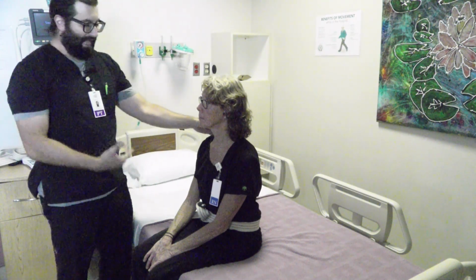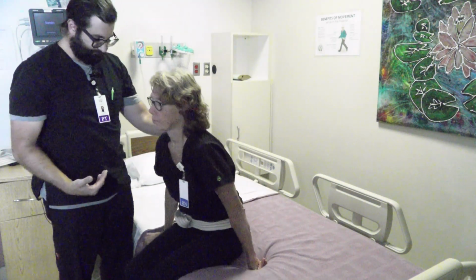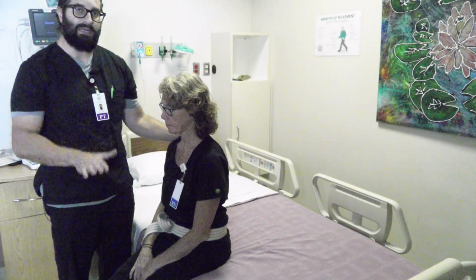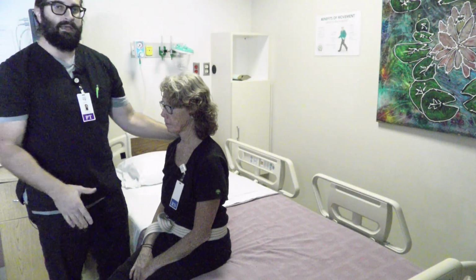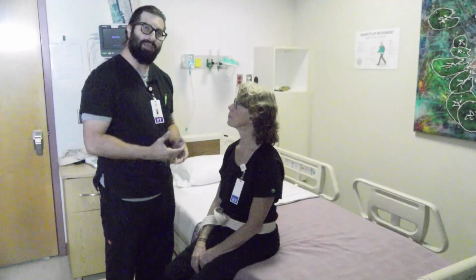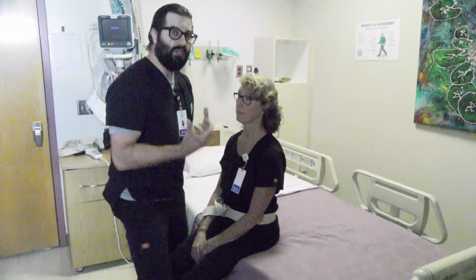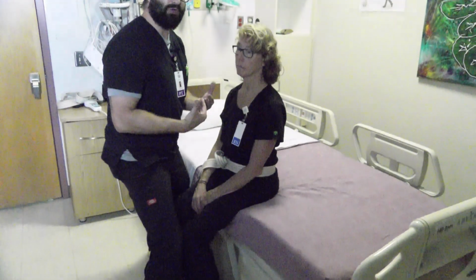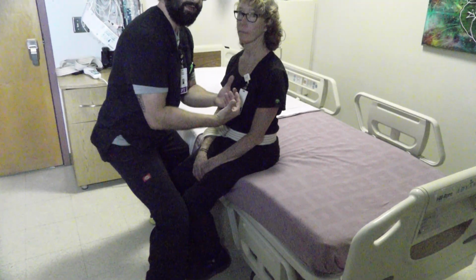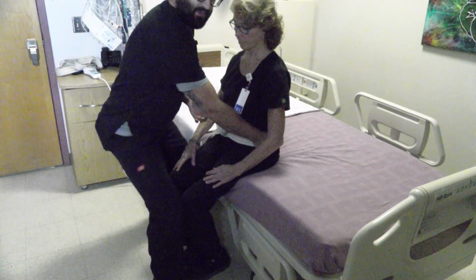So what I would ask the patient to do, if they can, is scoot a little bit more forward on the bed. You want their feet to be on the floor. That's very, very important. They need to be able to contact the floor. So what I'm going to do is I'm going to get close to the individual like this. You want to make sure that you spread your legs and get around them like so. And then you want to lower yourself by bending your hips and knees. So now I'm down close to where the patient is, okay? And then I'm going to grab on each side of the belt like so.